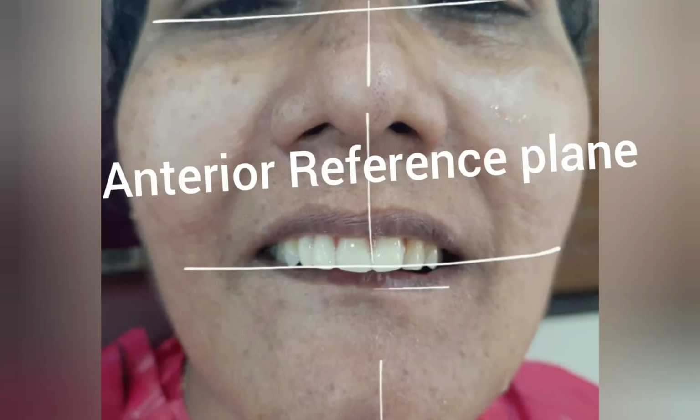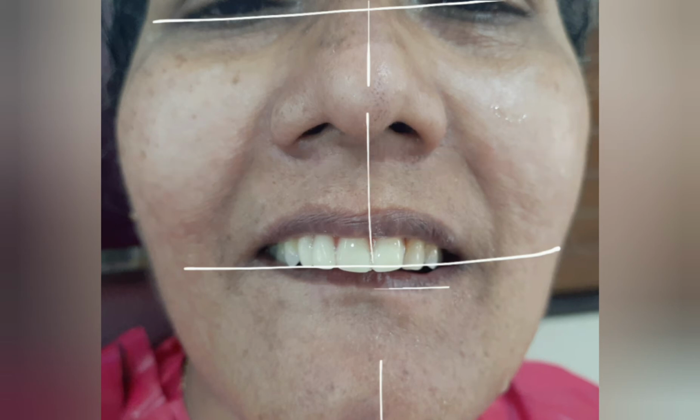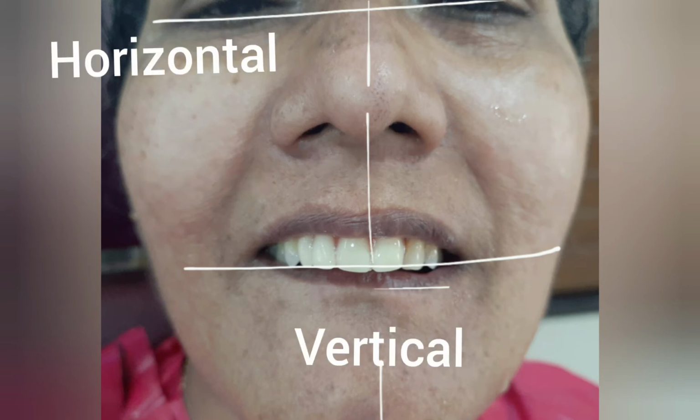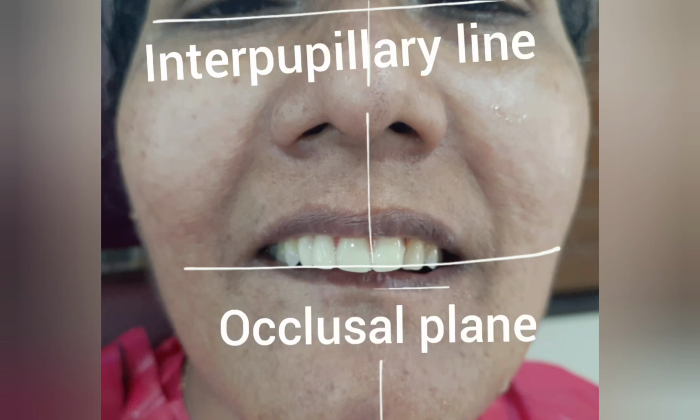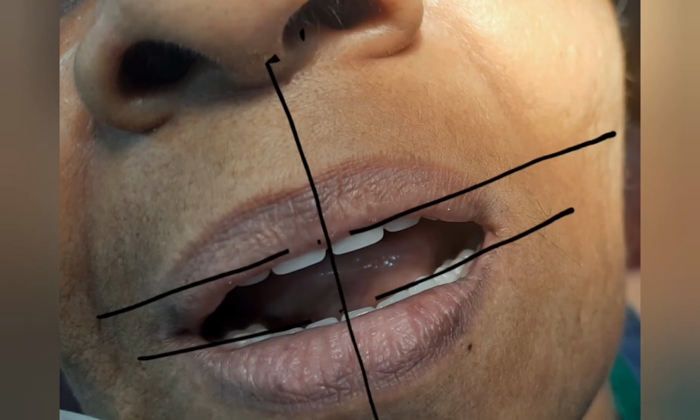There are two very important lines in the frontal plane. One, the horizontal plane, and two, the vertical plane. The horizontal plane has to be parallel to the interpupillary line, while the upper maxillary occlusal rim is placed in the patient's mouth.